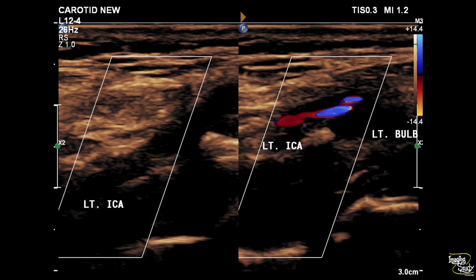We have checked the internal carotid artery. You can see the carotid bulb showing narrow luminal flow with aliasing, and just after the proximal part there is no detectable flow within the internal carotid artery. The lumen is filled with predominantly sonolucent plaque — that is the Type 1 plaque.